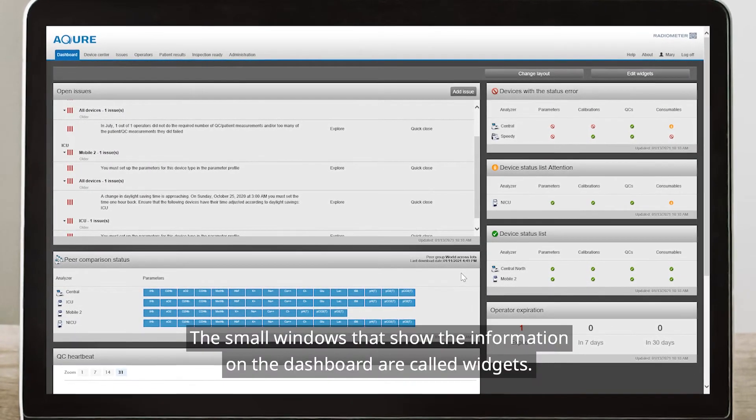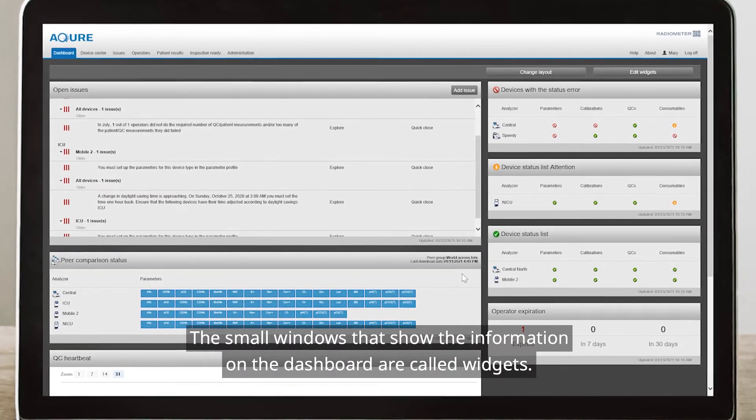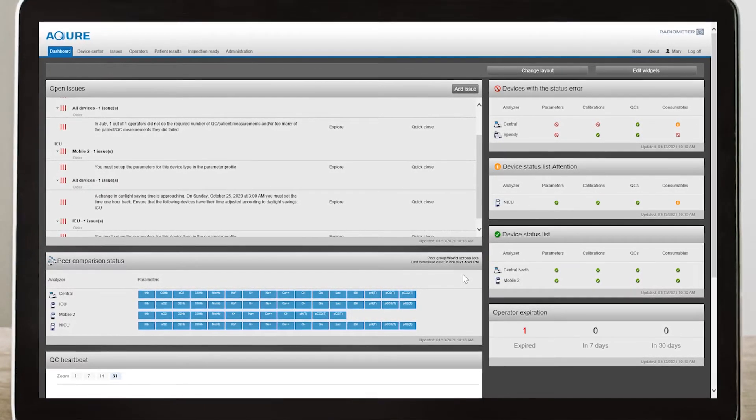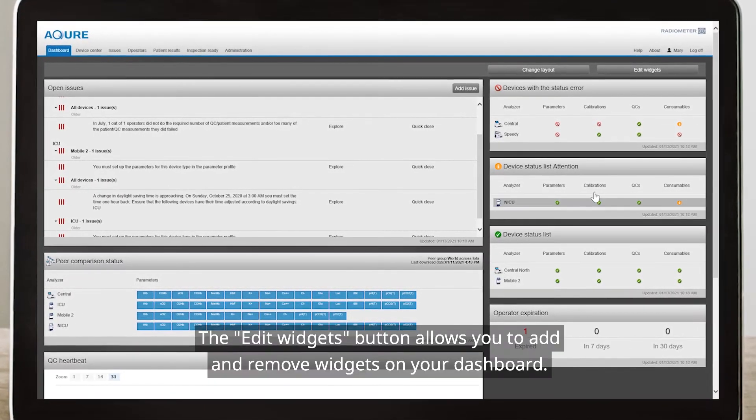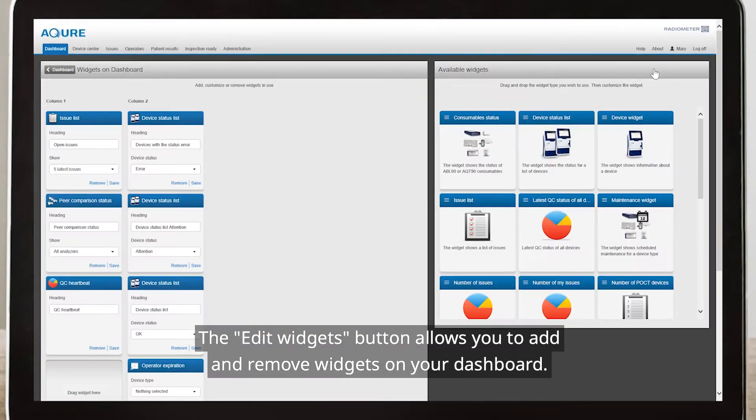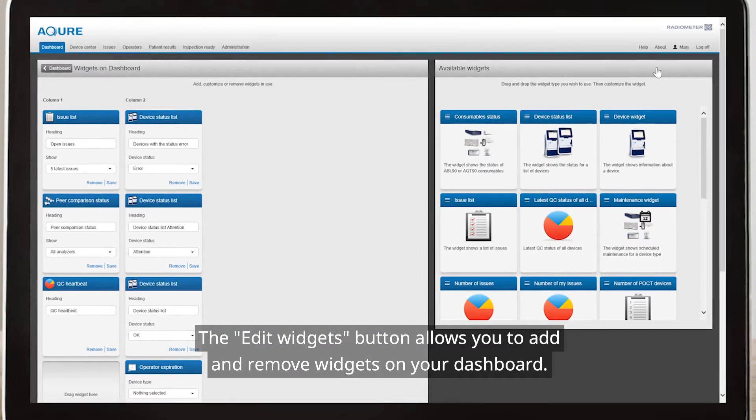The small windows that show the information on the dashboard are called widgets. The Edit Widgets button allows you to add and remove widgets on your dashboard.